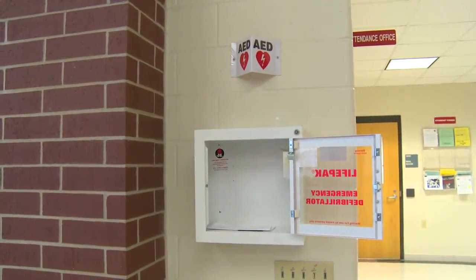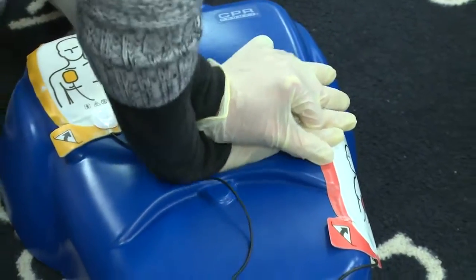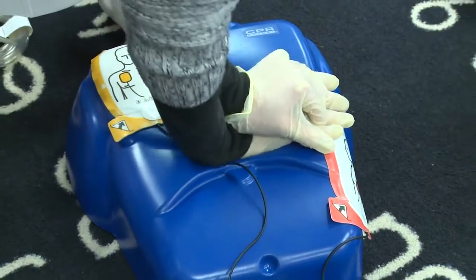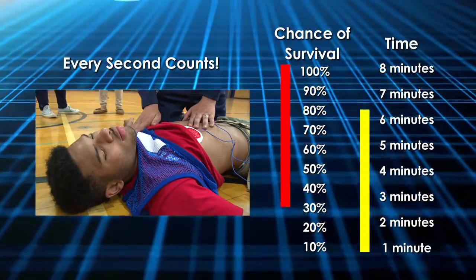Storing an AED in a highly visible, easily accessible, and central location rather than behind a closed door can mean the difference between life and death. Once help is on the way, it's important to continue CPR with the AED connected until EMS arrives. All events requiring CPR and/or the use of an AED should be reported to your nearest Project Adam coordinator. Remember, minutes matter in responding to a cardiac arrest.